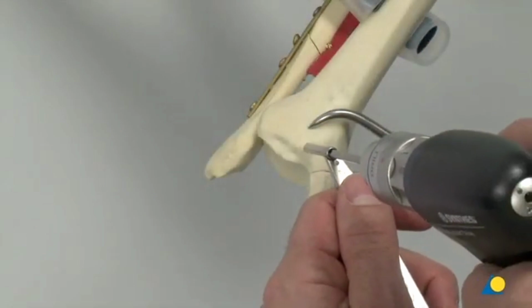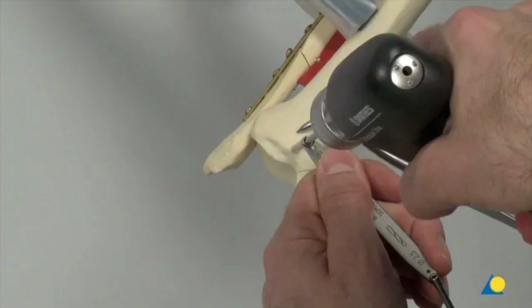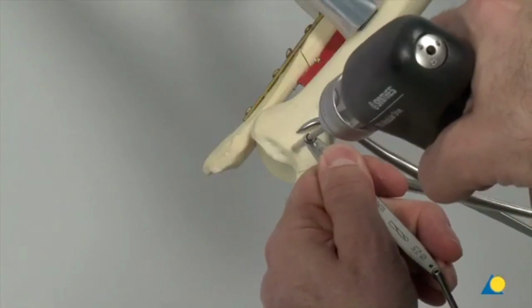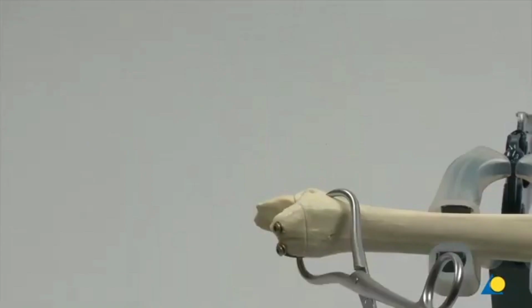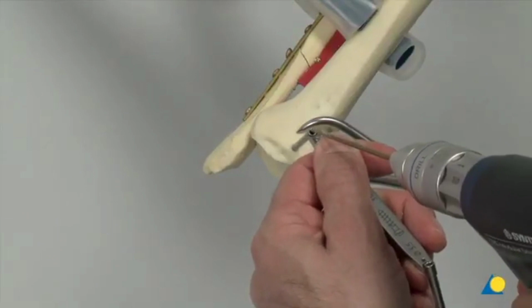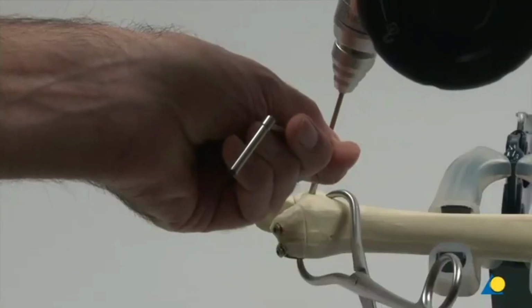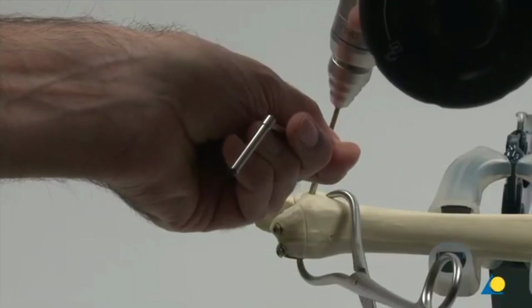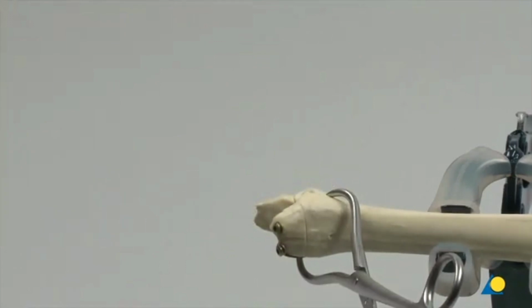From anteromedial to posterolateral, a 3.5 mm glide hole is drilled using the 3.5 mm drill bit and the 3.5 mm end of the universal drill guide. The 2.5 mm end of the drill guide is inserted into the hole, and the 2.5 mm drill bit is used to drill the thread hole into the posterior malleolus. This is the lag screw technique. However, the 4.0 mm partially threaded cancellous bone screws with 2.5 mm drill bit technique can also be used.